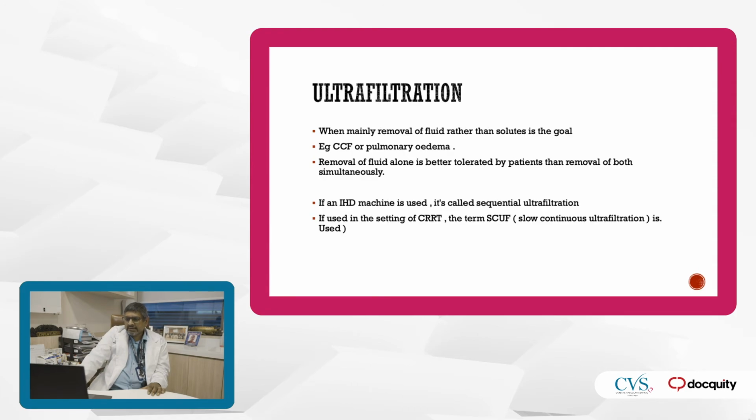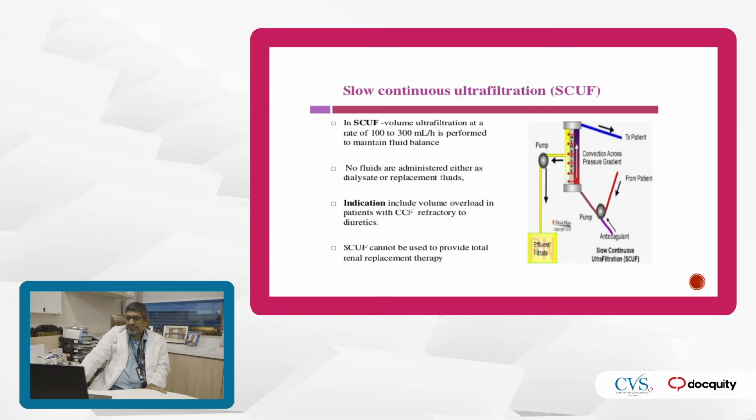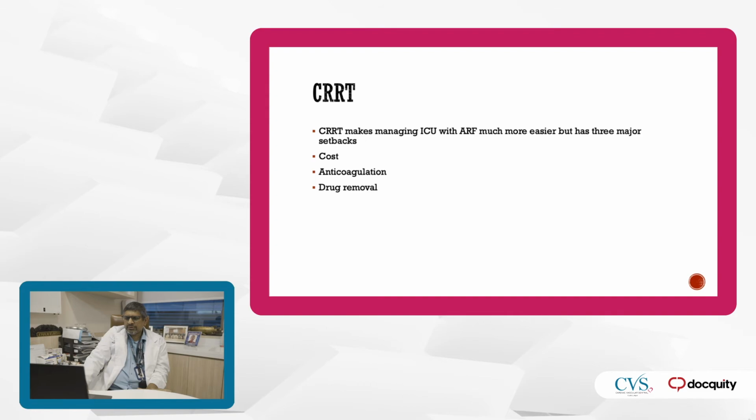Okay, like I mentioned, ultrafiltration is what we do when we only want to remove fluids alone. And this is the system of the SCUF, whereby you remove the fluids over a slower, longer period of time, and you do not replace them with any dialysate or replacement fluids.